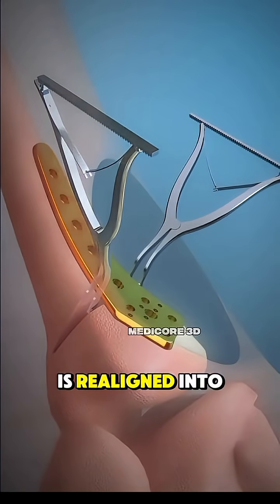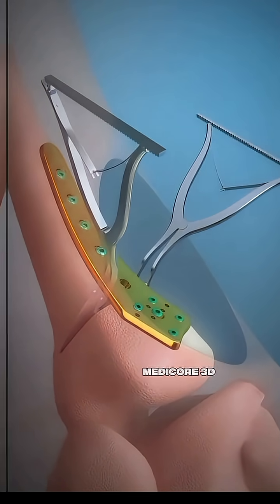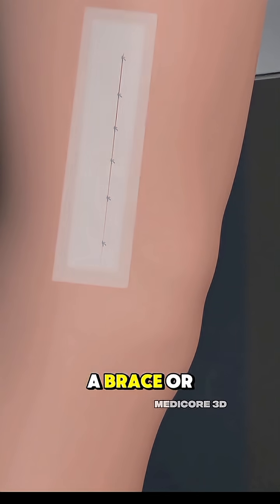Once the bone is realigned into the proper angle, it's fixed in place using a metal plate and screws. The incision is then closed and the leg is placed in a brace or cast.